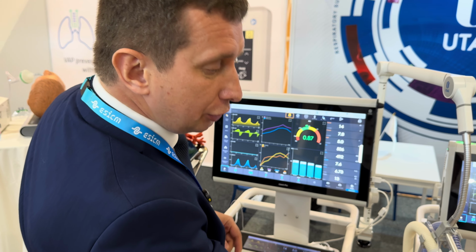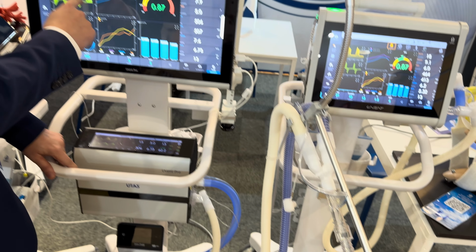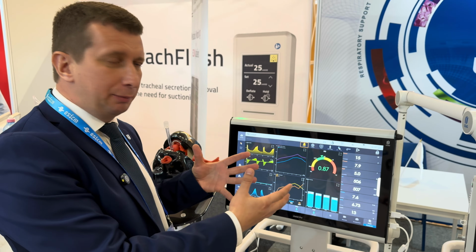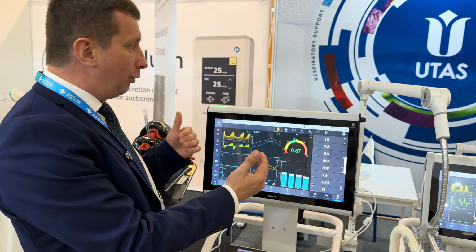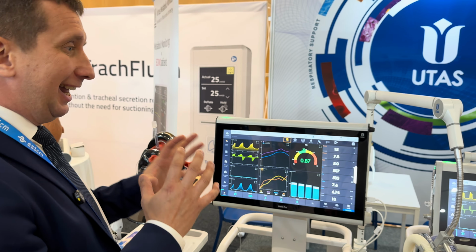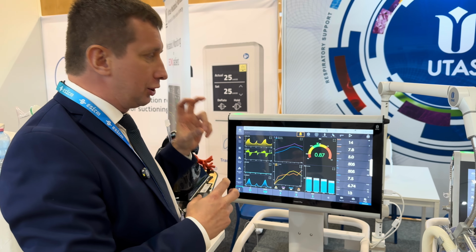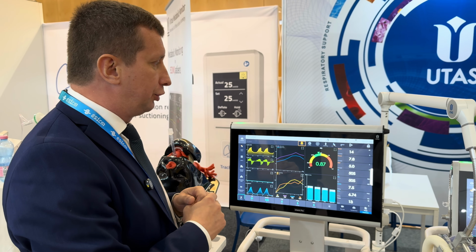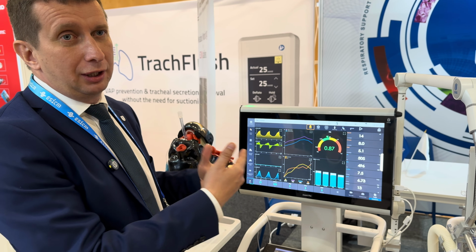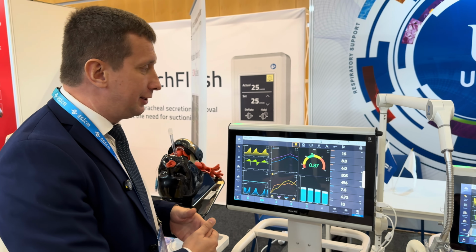The ventilator uses the flow sensor and volumetric measurements to calculate, breath by breath, the volume of CO2 exhaled by the patient and the volume of oxygen consumed during the ventilation process. By this amount of oxygen consumed and CO2 produced, the system calculates the energy spent by the patient staying in the ICU.